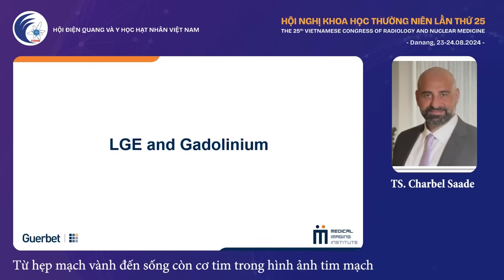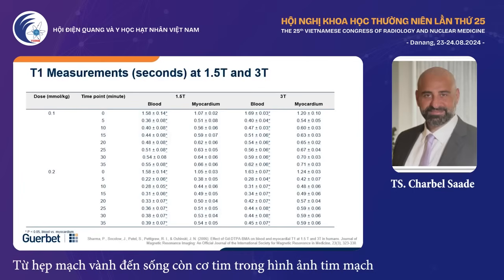We know that we have stenosis, we have CT FFR, but sometimes this is not available. So let's look at late gadolinium enhancement. Whenever we're looking at late gadolinium enhancement, we have to remember not all contrast agents perform the same way. Because if you think about a 0.5 concentration versus 0.1, ideally when it comes to body weight, they're still the same. So let's just take a look.